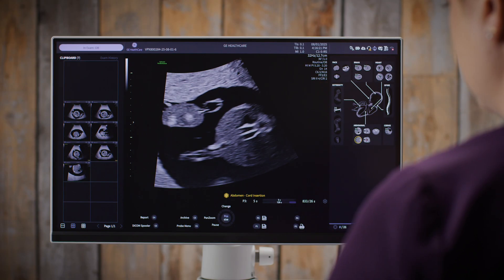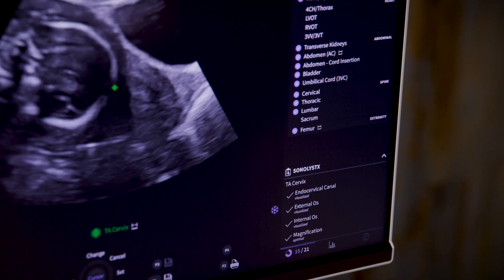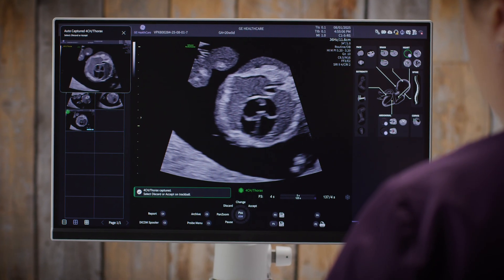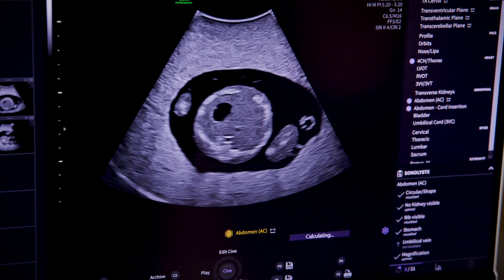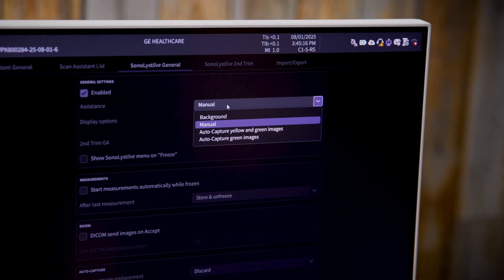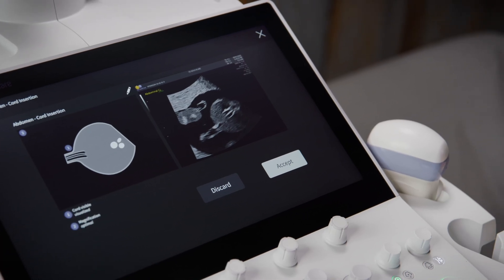Now for the most automated option: Auto Capture Assistance. This is where AI really shines. As I scan, the system automatically captures, annotates, and checks off views in real time. If a measurement is needed, it prompts me right away. Each image is graded — green meets all standard clinical image criteria for that view, and yellow meets most of the criteria. Both provide diagnostic quality images. You can choose to capture just green images or both green and yellow — it's totally up to you. Whether you want to accept or discard images as they're captured or wait until the end of the exam, you're in control. This method saves time, reduces repetitive tasks, and helps ensure your best images are the ones that make it into the study.